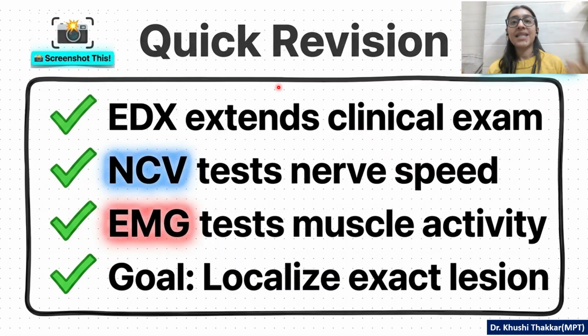Question 1. Second question: if a patient comes with wrist drop and complete radial finger drop, okay? Now, this patient says that this has been happening for the last 2 3 days. That is, it is an acute condition. Now, in this acute condition, what is the reason? Is it a conduction block? Is it axonal injury, or is it a demyelination?